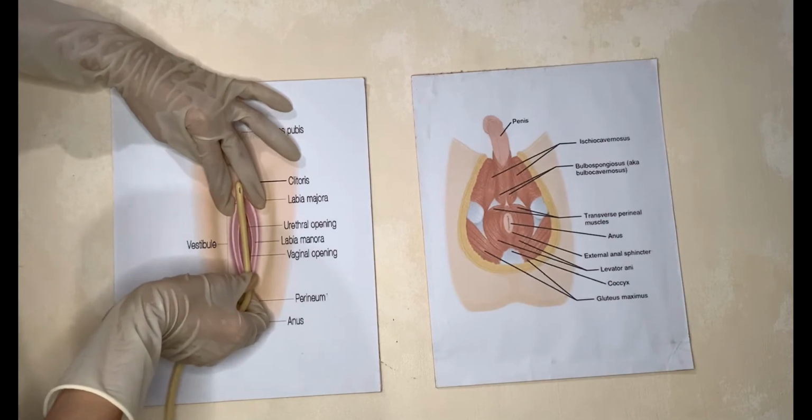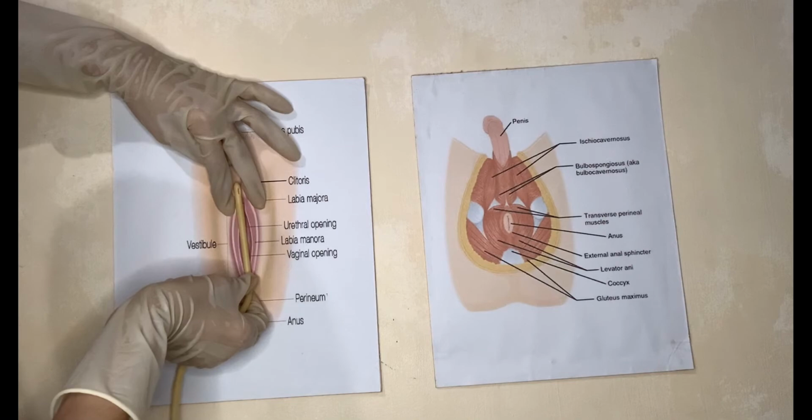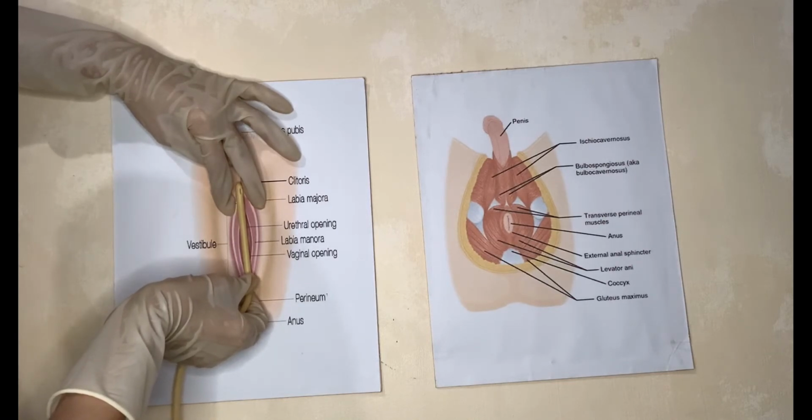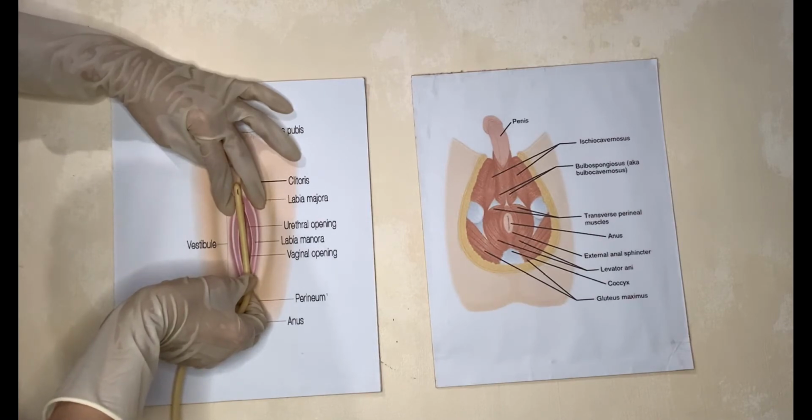For an indwelling catheter, inflate the retention balloon with the designated volume without releasing the catheter, and for females, without releasing the labia. Hold the inflation valve between two fingers of your non-dominant hand while you attach the syringe if it is not left attached earlier, and inflate with your dominant hand.